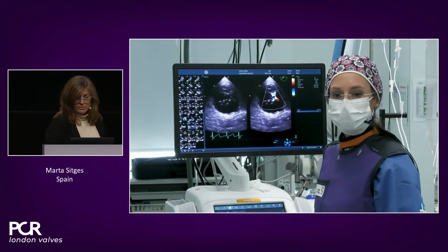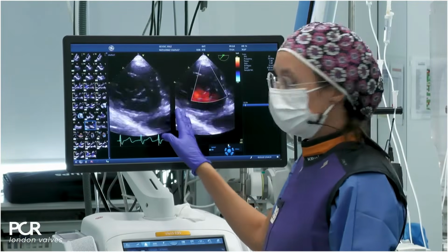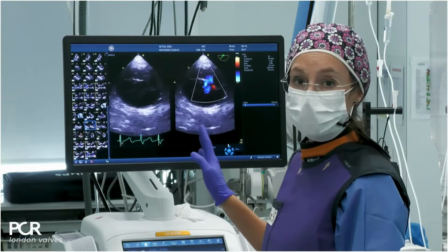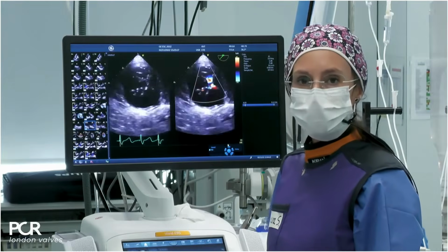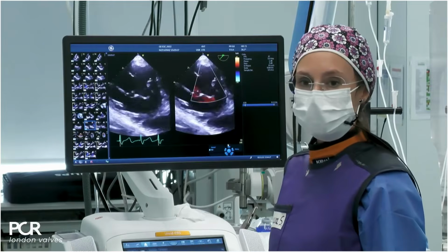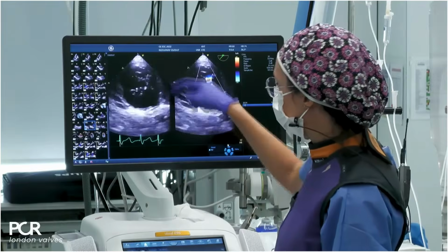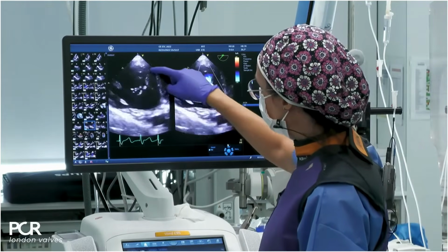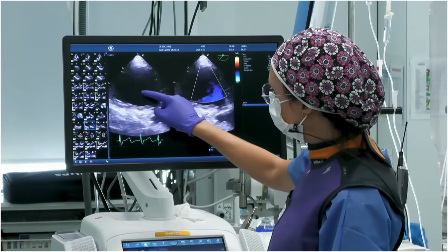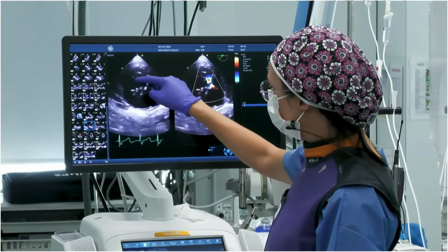Now we are showing the TOE that we just repeated now in the cath lab. As you can see, I want to start with the transgastric short axis view just to have a look at the anatomy of this valve. As was said before, this patient initially had a big gap. So regarding the amount of the gap of the patient and also the anatomy, as you can see here, it's a 4-leaflet tricuspid valve. You can see here the septal leaflet. This is the anterior leaflet that also has one scallop here. This is the papillary muscle, and we have here a posterior leaflet with 2 segments.